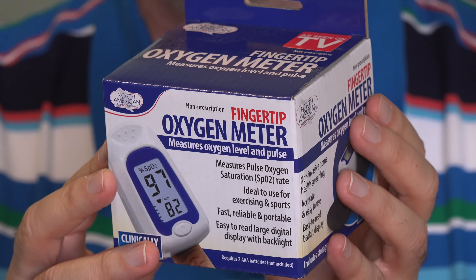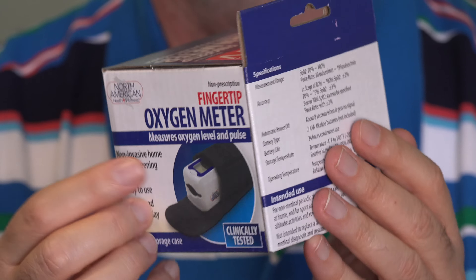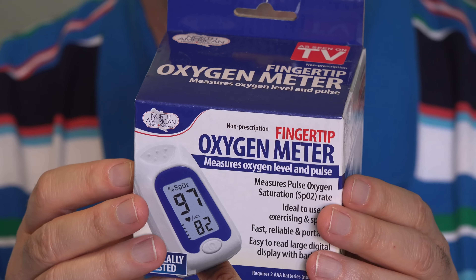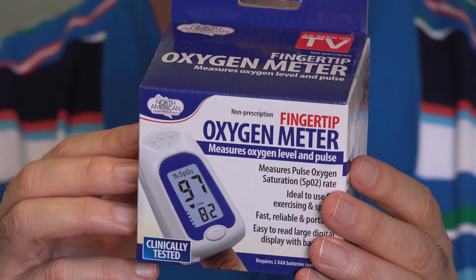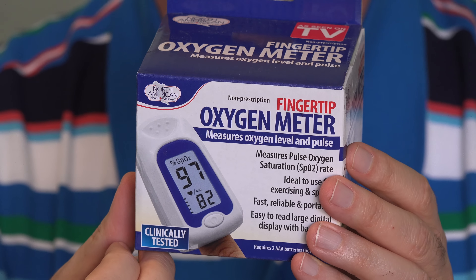For just over $30, you can find out how your oxygen levels are doing right at home — I'll put a link down below this video. I found it over at Fry's in the as-seen-on-TV section. It takes a couple of AAA batteries, and it is pretty much as simple as just clicking it onto your finger, just like they do when you go into the doctor's office. Give it a few seconds and it will give you a reading not only of your blood oxygen saturation, but also your pulse.